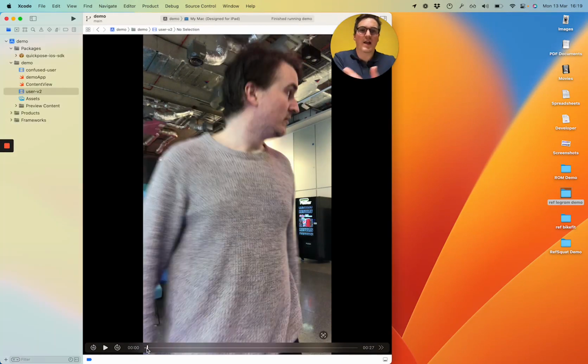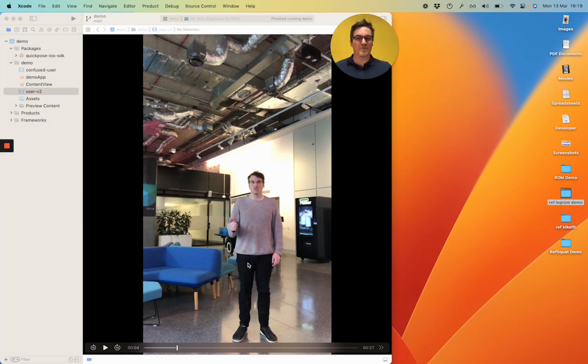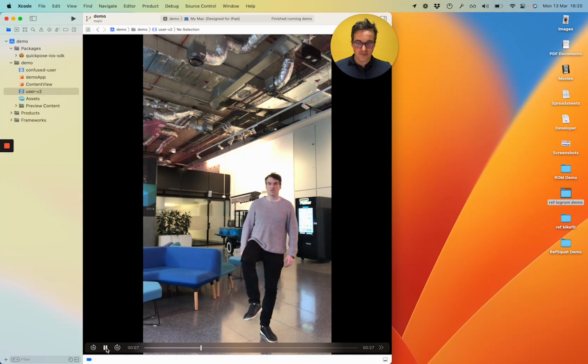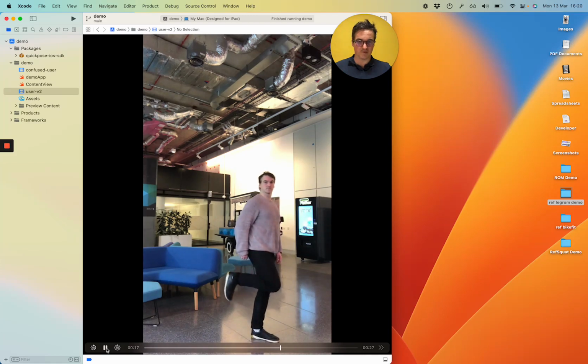This is what I need for the user's experience to be. So I step back and then I prompt the user with some message, and then I ask for a thumbs up. So the thumbs up allows the user to say, yeah, I'm ready to continue, so that you're not talking over them or going too fast for them. The next step will be a message saying, oh, lift your leg in this certain way. And we're doing that leg. This is the lateral flexion I was talking about. And then I'm probably going to show some result here, confirm the result, and then move on to the second measurement.